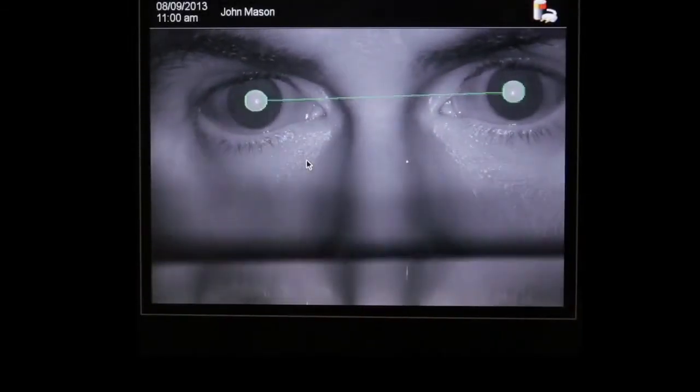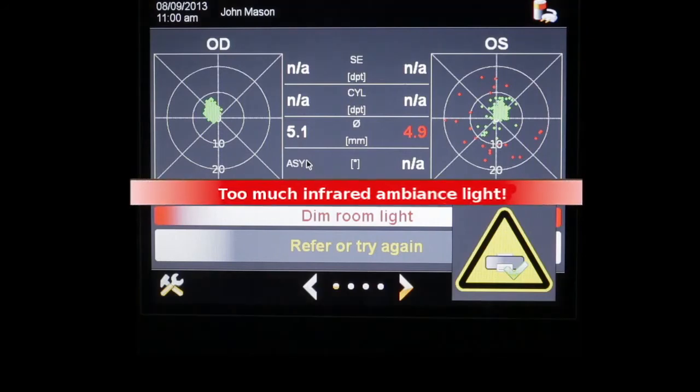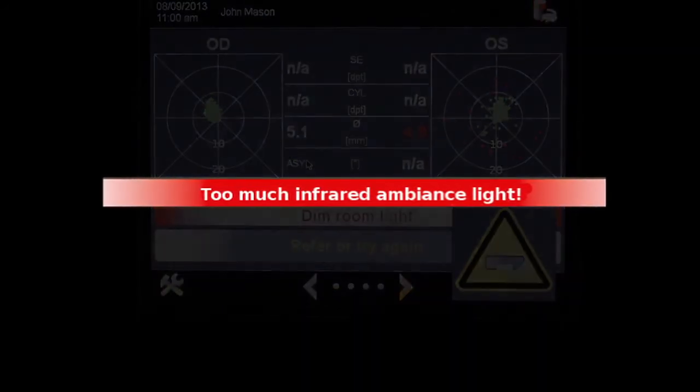Note that during a screening you may receive an error message. If the error message reads "Too much infrared ambient light," you will need to dim the lights in the room or shade the windows. If the error message reads "Camera did not detect pupils," make sure hair and eyelashes are not blocking the eyes.